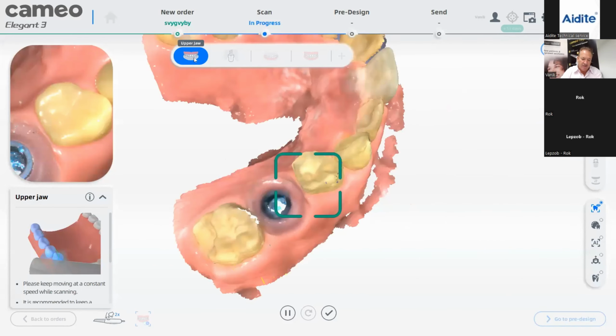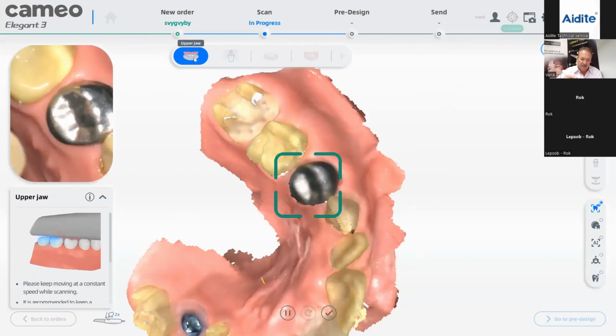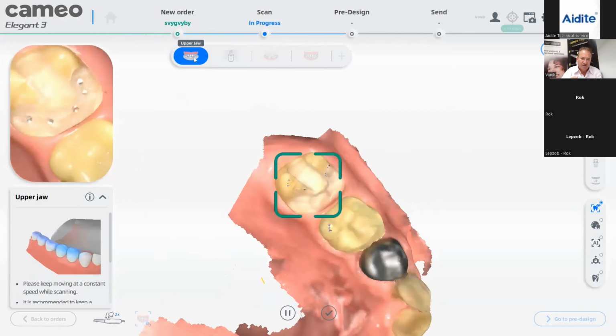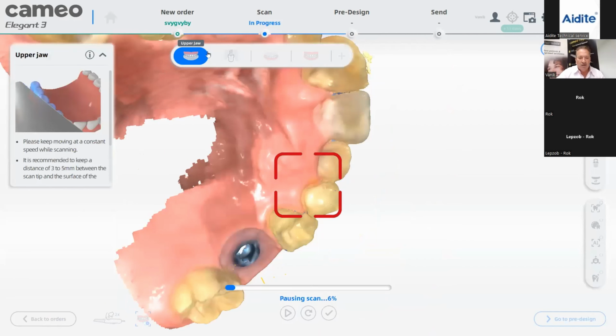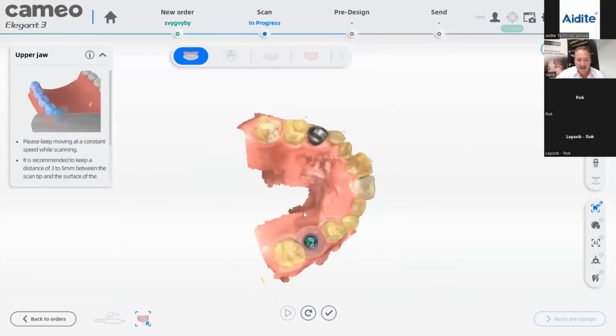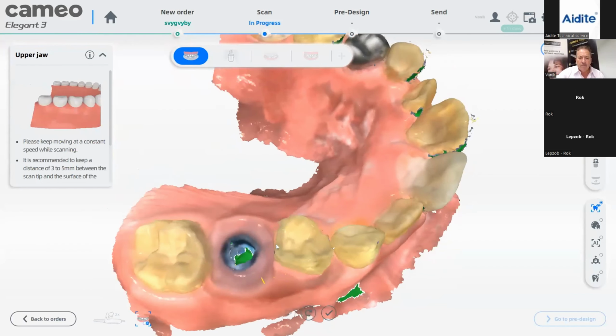Okay. Now it depends on the situation. I'm just doing this really fast, not to lose too much time. Normally in this situation, the dentist would try to remove the healing part, what you call the healing cap, which is in here. If he doesn't remove the healing cap, then you just scan it with the screw in there, okay? And you have to judge it yourself. Be sure that the contacts are good. Here, the contact is not so good. This is the most important thing here, that the contact is good. This side also. The rest is not important on this scan. So this is the first scan.